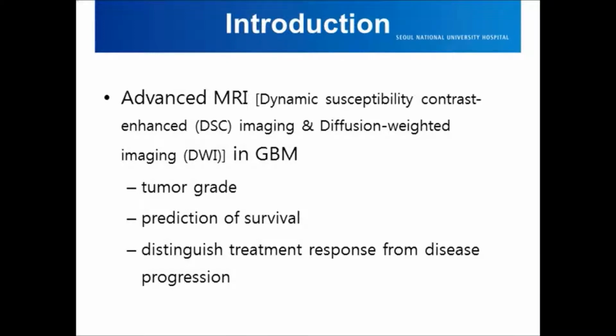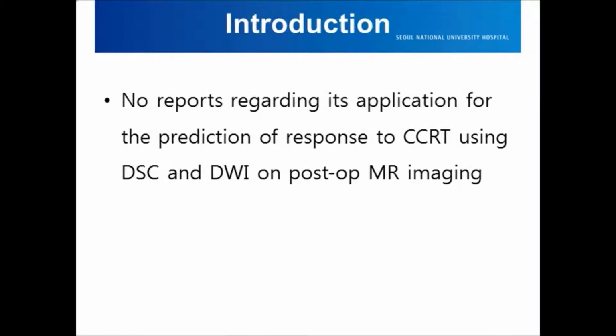Several studies revealed that MR perfusion and diffusion imaging is sensitive for tumor grade, prediction of survival, and distinguishing treatment response from disease progression. However, there have been no reports regarding its application for the prediction of response to CCRT using DSC and DWI on post-op MRI imaging.